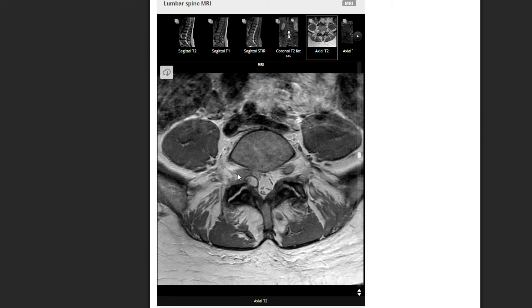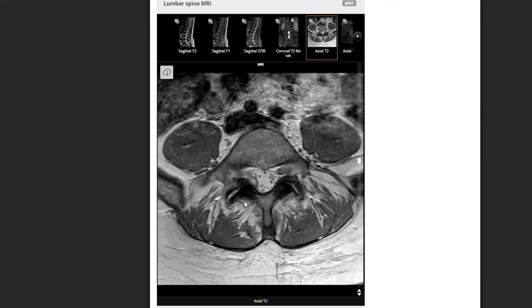This is the dorsal root ganglion — the little grayish structure here — and a normal one over here with lots of space. On this side the cyst is pushing on it. A large joint could also close this space and narrow the amount of room that a nerve has to pass in between the disc and joint.